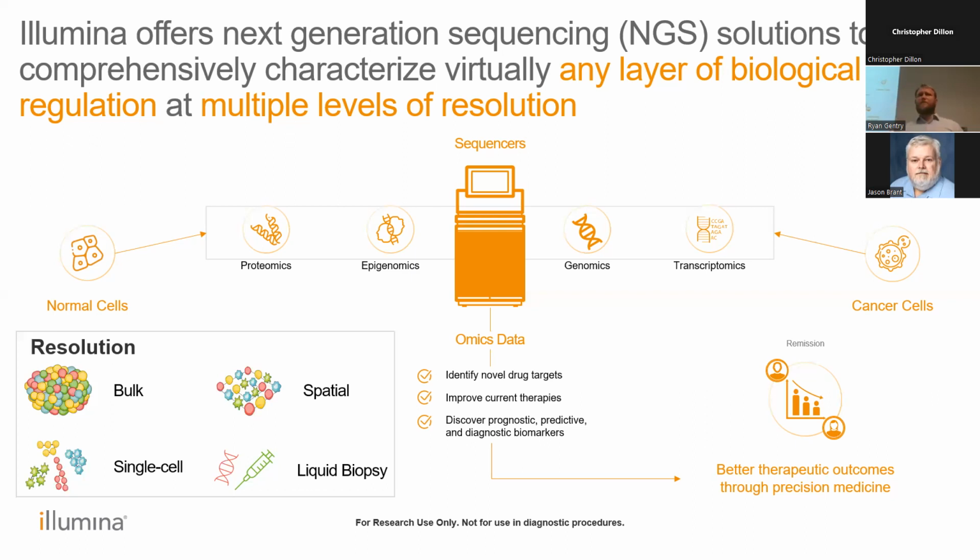And then the last thing is liquid biopsy. We'll go over this in a little more detail in the fourth section. But really what we're looking at here is that sometimes we're not going to be able to excise tumors out of patients. So we need other ways to identify, say, biomarkers within patients, to see if there's cancers that are happening or developing within specific patients. So liquid biopsy is probably the most up and coming of these specific assays that we're going to be speaking of today.